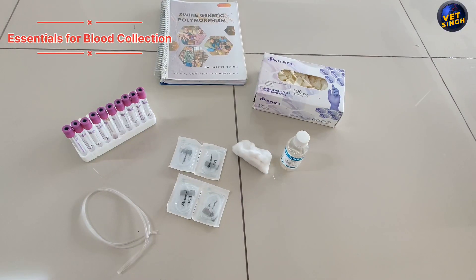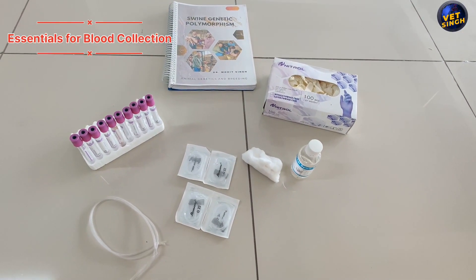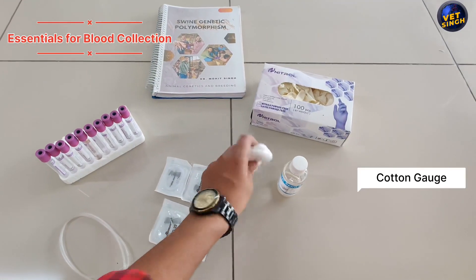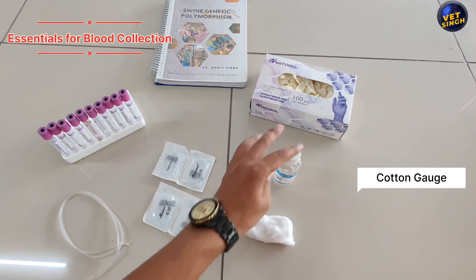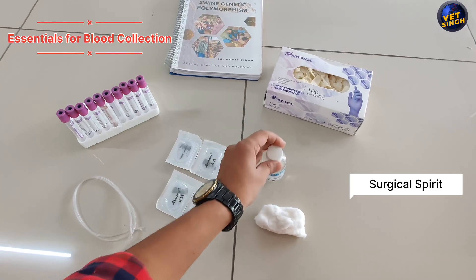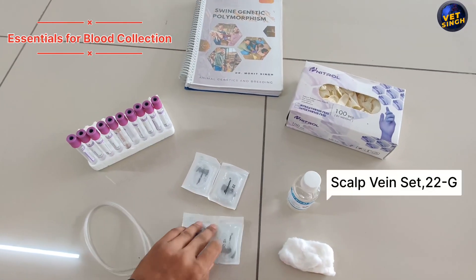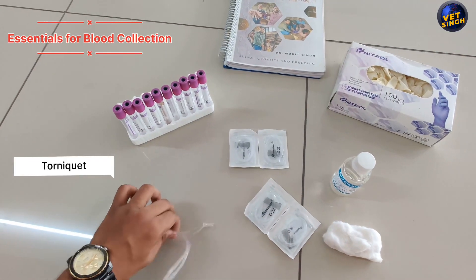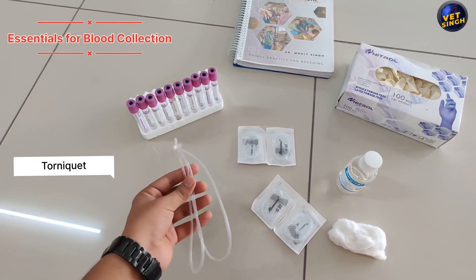Today I will teach you how to collect blood samples from the recurrent tarsal vein. For blood collection in piglets, we need some basic essentials: cotton gauze along with surgical spirit, and a scalp vein set of 22 gauge, plus a tourniquet which is applied on the legs for blood collection.